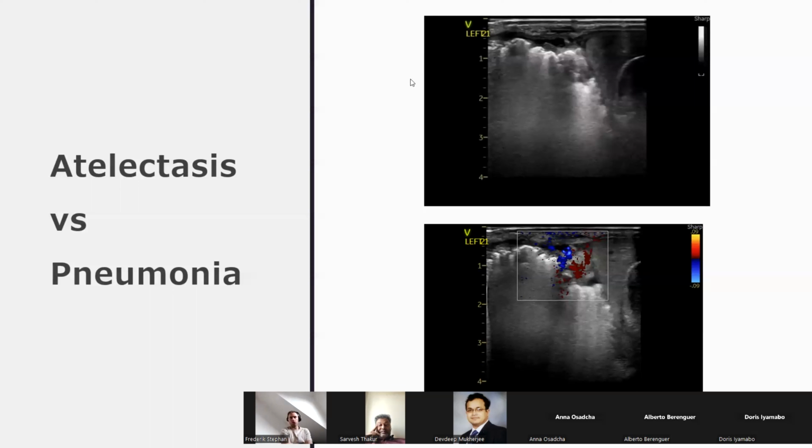Anna? Anna Vaz? Hi, Alok. Hi. So just without the history, this is the left. It's basically L2.